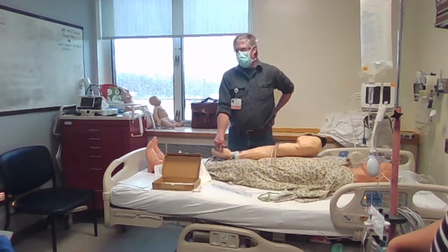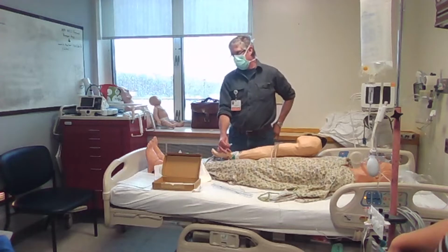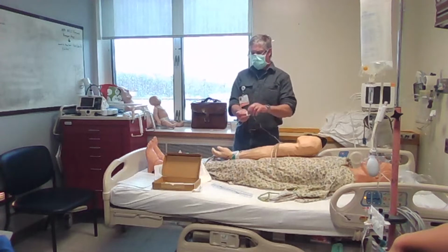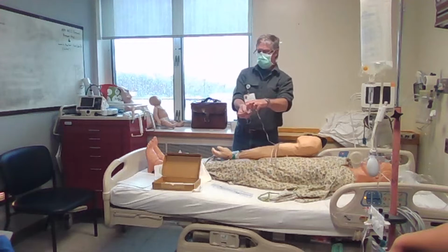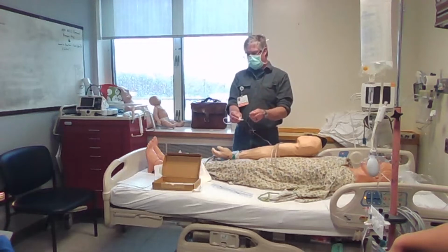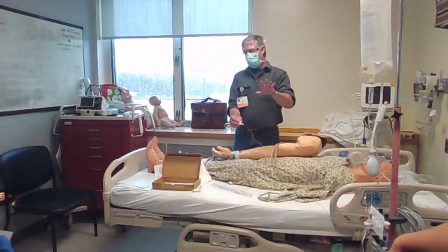Keep it very simple. Those little caps had the holes in it, so it will let any air out essentially? Well, you took those off with the holes because, one, you want a sterile system, because those holes would be in contact with your liquid. So you took those off after you prime it, or right after you prime it, and you make sure there's no air in it.